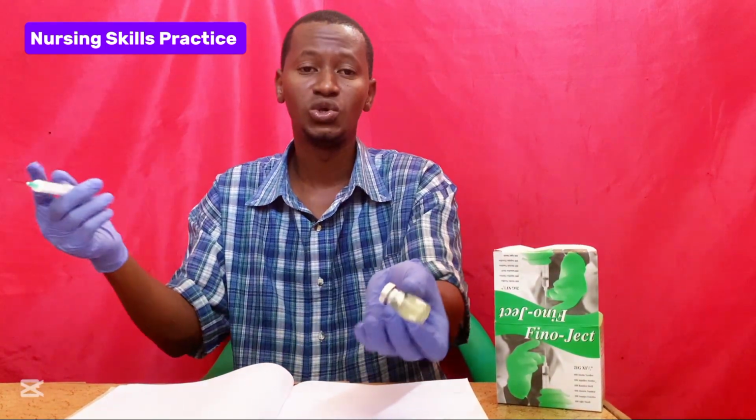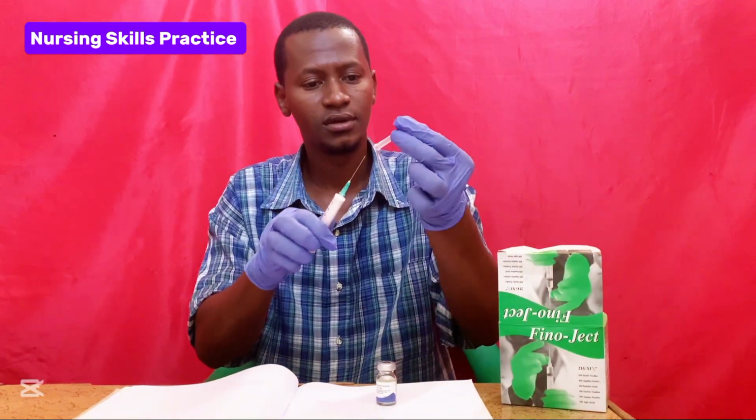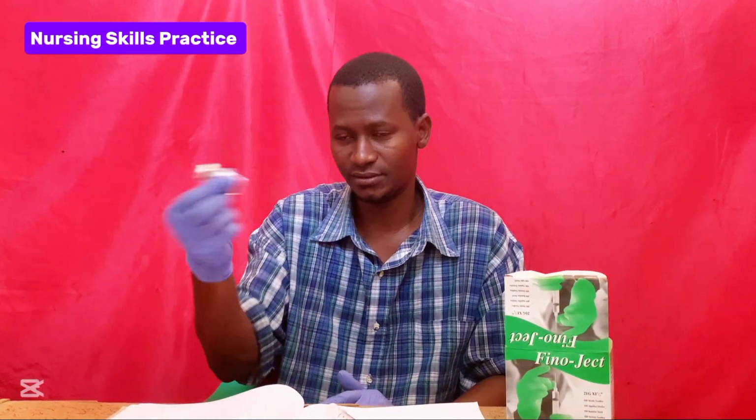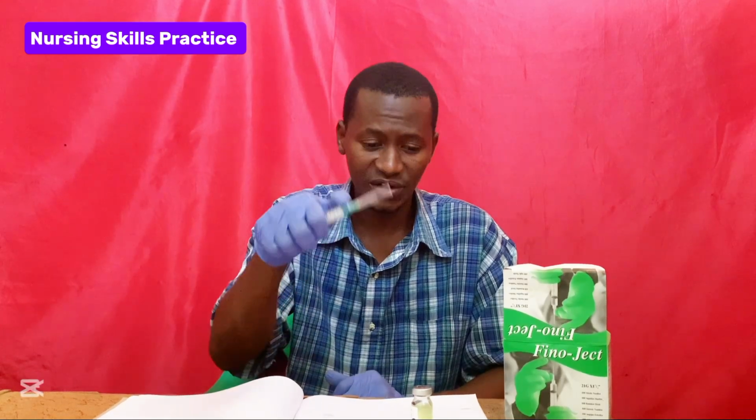When you finish, you remove the syringe, put back the cap of the needle, then start shaking the vial gently like this until all the drug is completely dissolved. This is how you are going to shake the vial gently so that the drug can be completely dissolved. Then when you finish diluting, you are supposed to withdraw the drug from the vial.